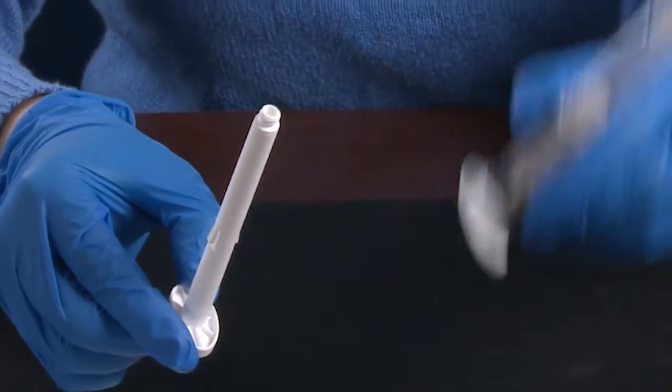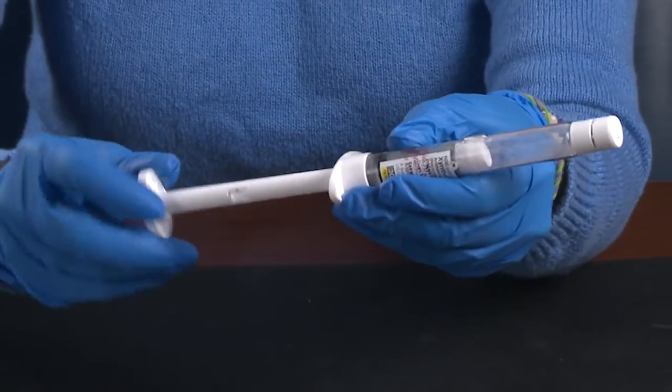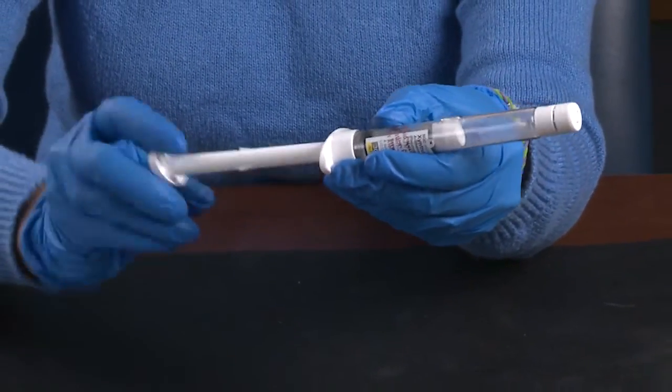First, grasp the plunger rod, being careful to avoid contact with the shaft of the plunger. Screw the plunger rod firmly into the opening of the SoloFuse syringe.